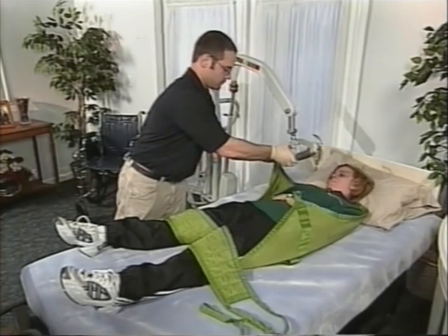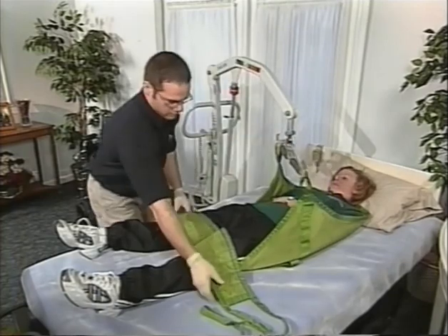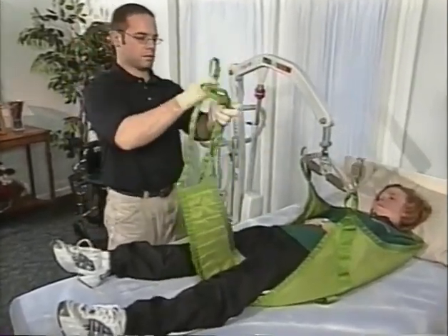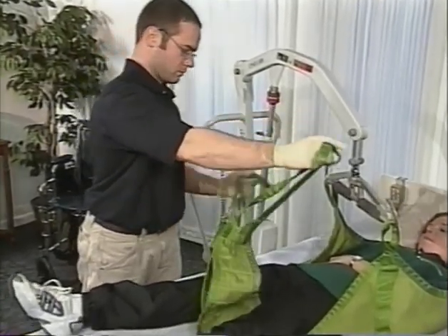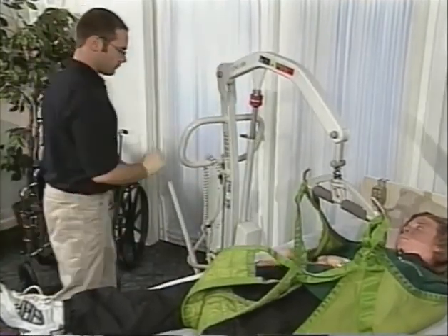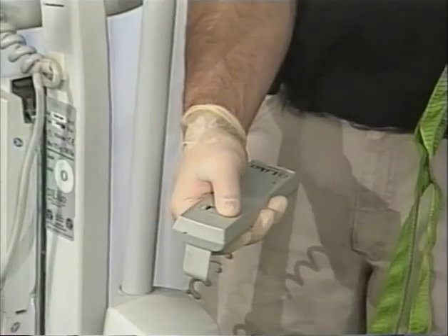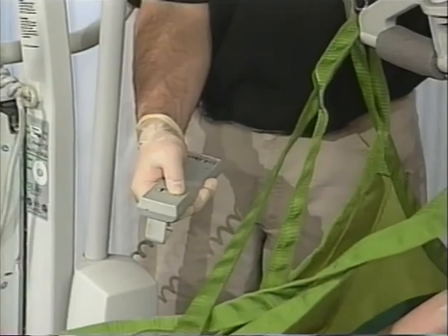Attach the sling to the hooks. Cross the right leg loop to the left hook and the left leg loop to the right hook. Raise the lift by using the handheld controls.